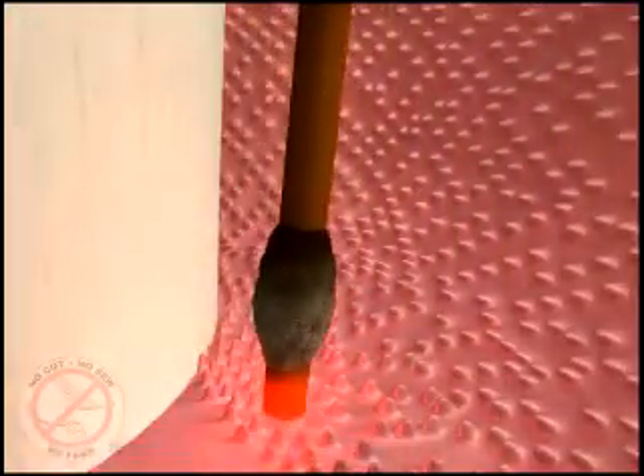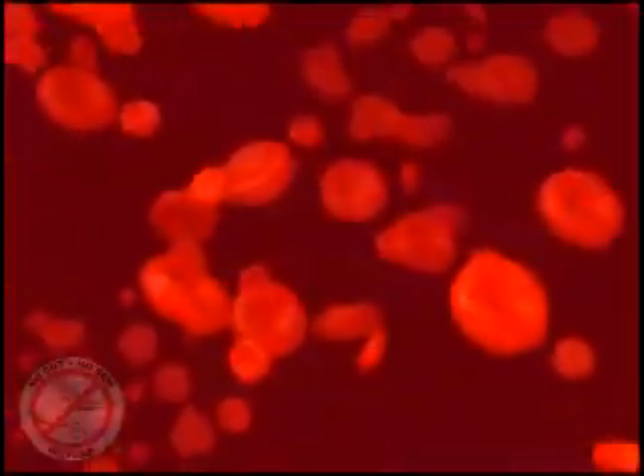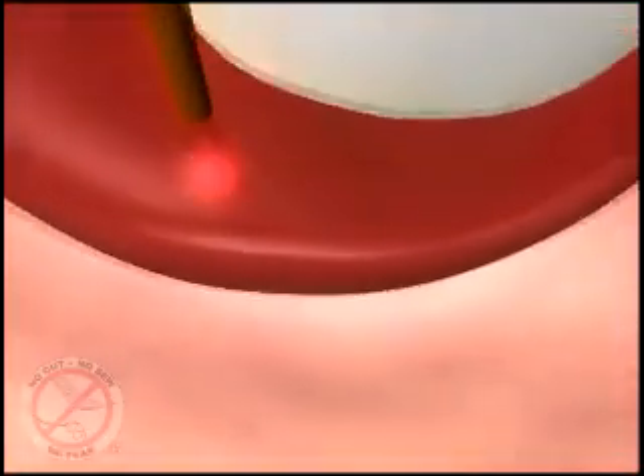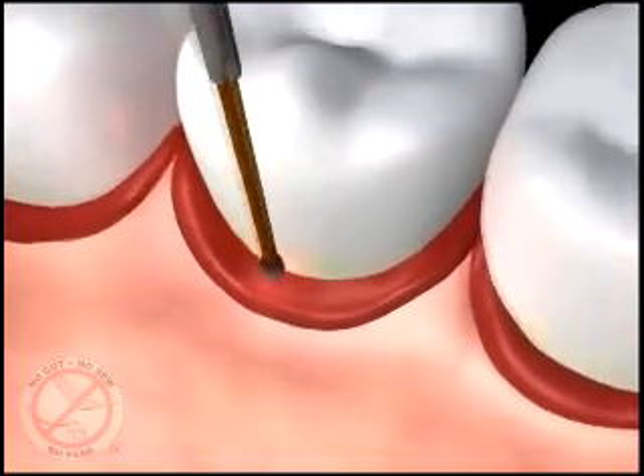It also stimulates the formation of a blood clot, which once formed contains fibers that reattach your tissue to the tooth surface and seal out debris and bacteria like stitches would, and creates the right environment to cause the bone and other soft tissues lost from the disease to grow back.